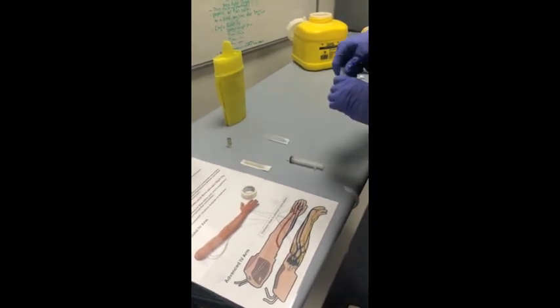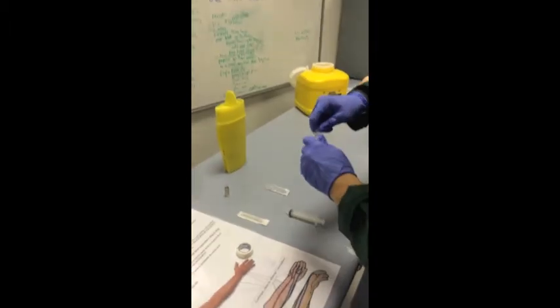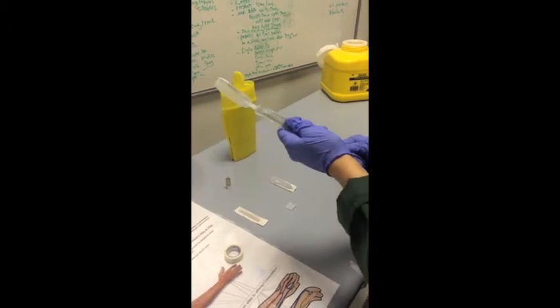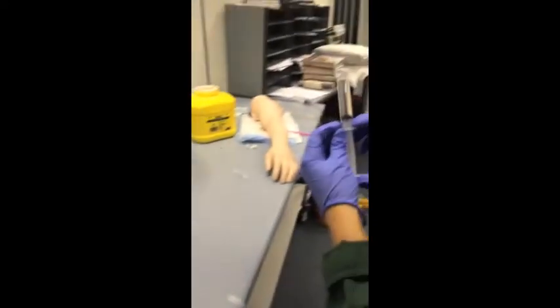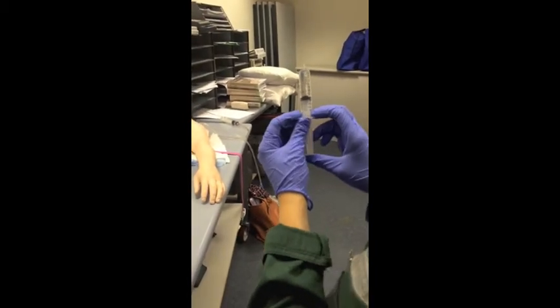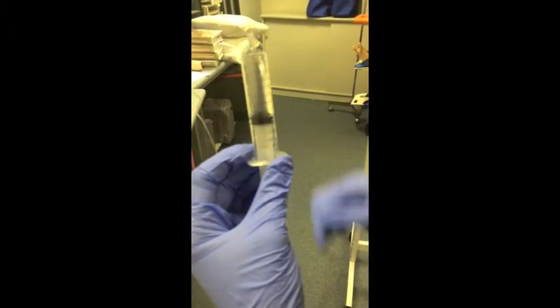I open the blunt needle from its sterile packaging but do not remove the cap. I draw up the 10ml of normal saline with the 10ml syringe. I only need 8ml as there will be 2ml of fentanyl being titrated, so I discard 2ml of the normal saline from the syringe. I put the empty saline cap back onto the syringe to ensure sterility of the tip.